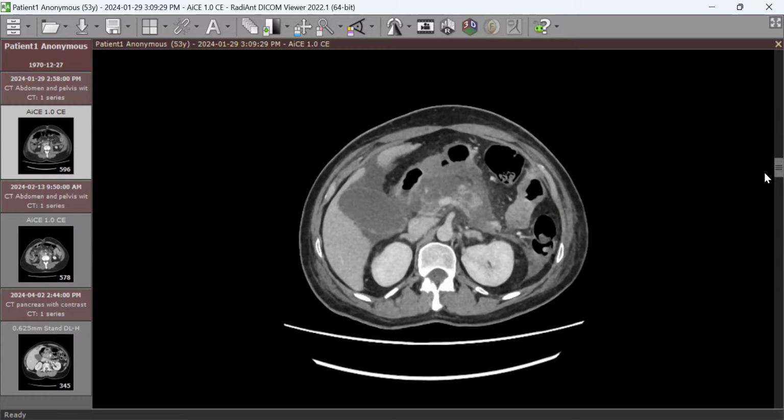Peripancreatic inflammatory changes and peripancreatic fluid collection on one side or both sides of the pancreas, all of these take 1 score. So the maximum score of the severity index becomes 10. More than 7 is considered severe severity index with high mortality rate.